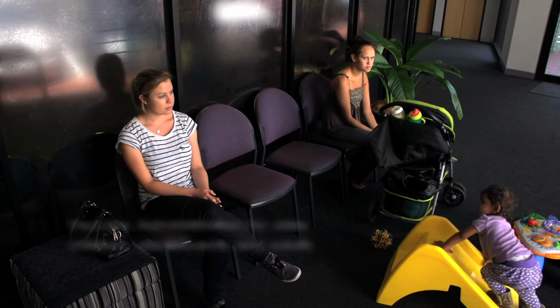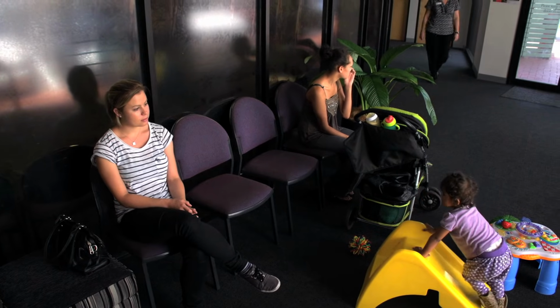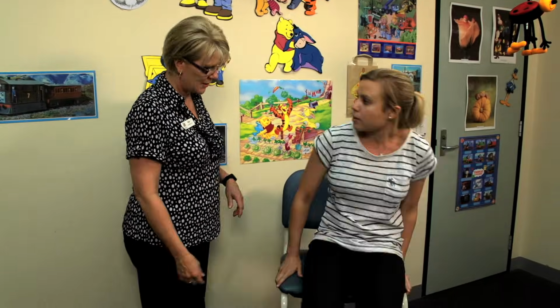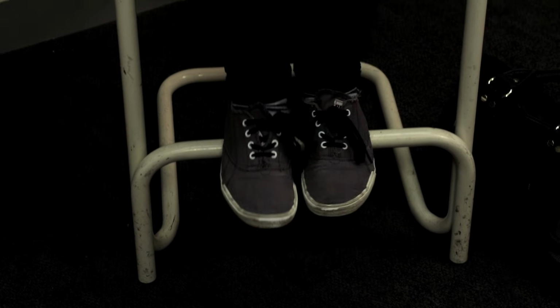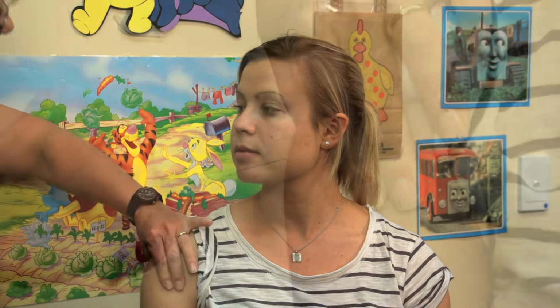This young adult has requested the Boostrix vaccine. For older children, adolescents and adults, vaccines should be administered into the deltoid area. Ask the client to sit in a straight-backed chair, feet resting flat, and their forearms and hands in a relaxed position on the upper thighs. Keeping the arms flexed at the elbow will allow the deltoid muscle to relax and be a less painful experience.